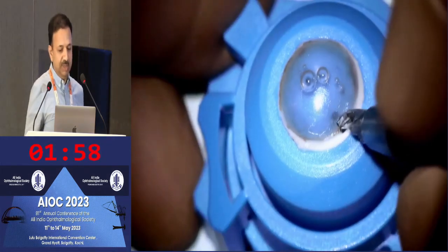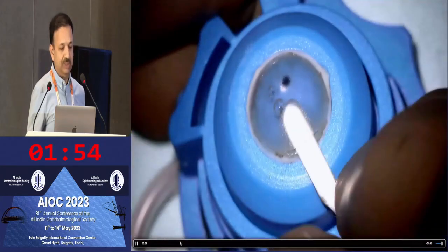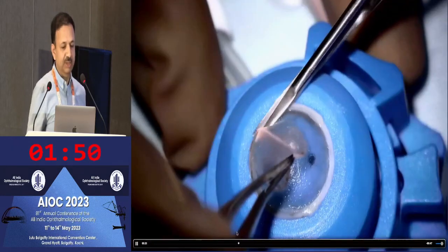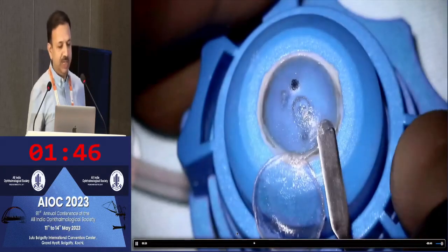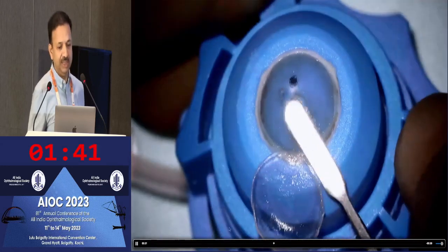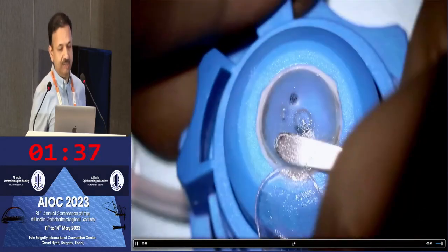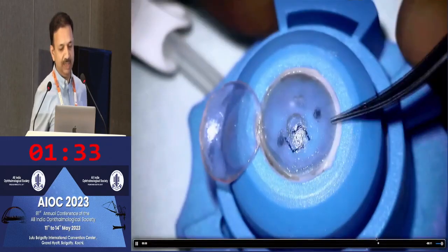This is something you can also prepare manually, where you perform the first layer of dissection, then cut at the edges to reflect the cap. You can then make a peripheral groove and do a second layer of manual dissection using the lamellar dissector. Thereby, you can prepare an ultrathin DSAEK graft manually as well by doing this double-layer dissection.